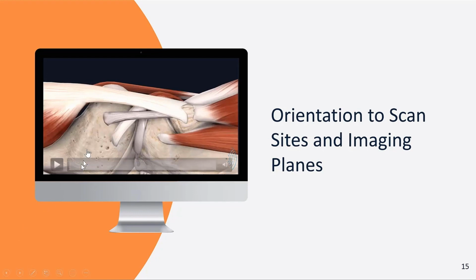We know the collagen fibers of the tendon structure and of ligament structures do not have microvasculature to them. So, if there is blood flow within that fibrous complex, that is an inflammatory event. So we're going to be taking this zone. We know the lesion is in the lower aspect of the lateral collateral ligament.